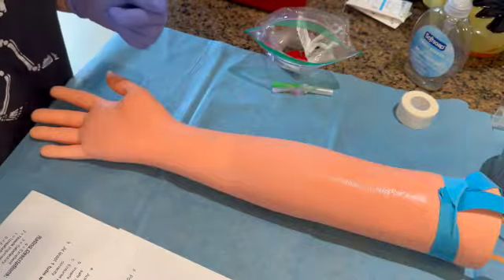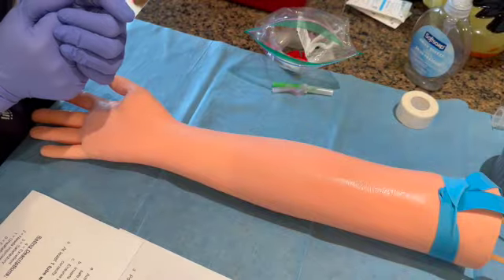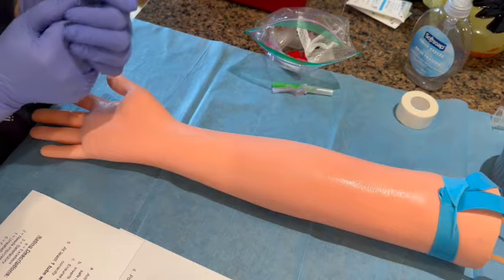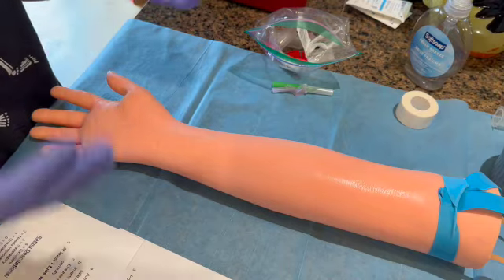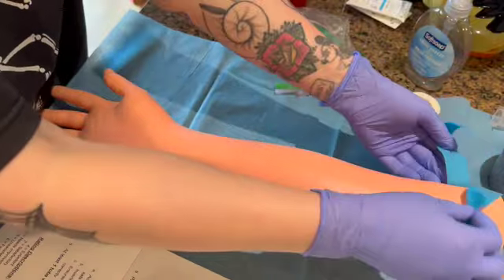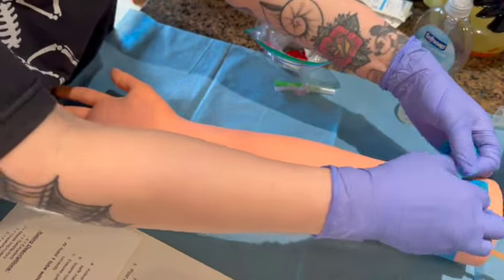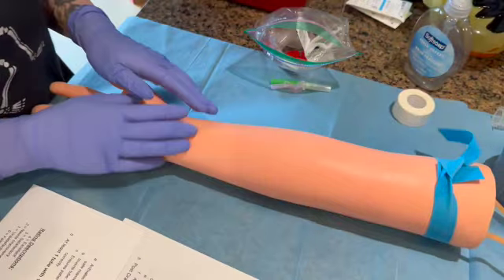And that'll go in the trash. We've selected our appropriate site. We've cleansed with the proper antiseptic technique. And we're also going to make sure that we're using correct timing by allowing that site to dry, which is where this would come in handy of having the tourniquet removed. We're just going to leave it on there since he's fake.